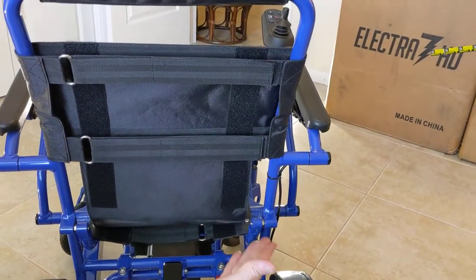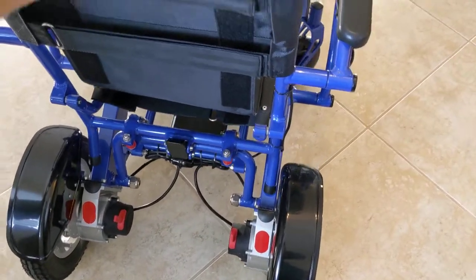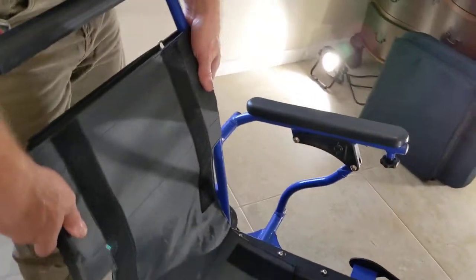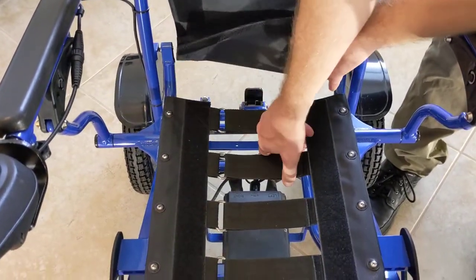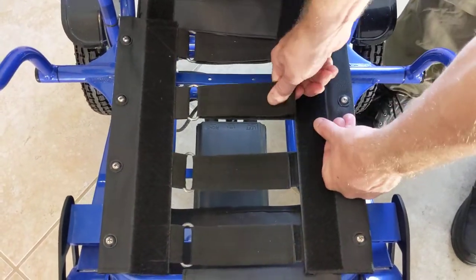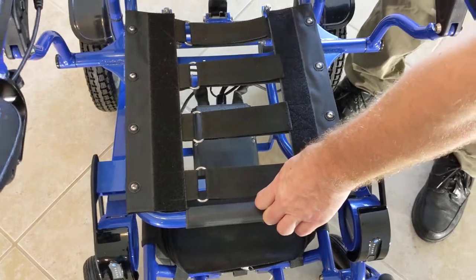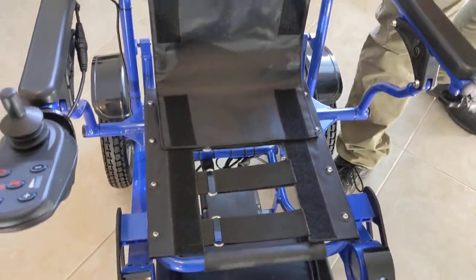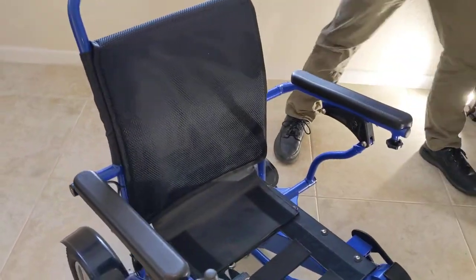This chair is 50 pounds without the batteries and 58 pounds with both batteries in. It is FAA travel approved. To set up the chair, I've made the seat more firm. You can pull the back up higher if you want, and by moving a few different velcro straps, you get a chair with good lumbar support that's nice and firm and ready to operate.